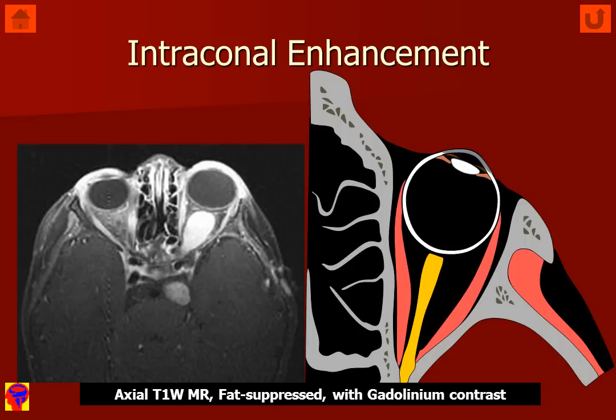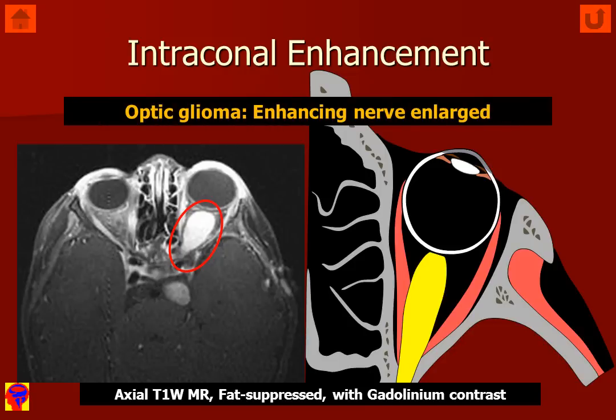If we have intraconal enhancement in a mass lesion, the differential diagnosis changes. We can see here that there is an enhancing mass in the center of the muscle cone. If we look at the diagram, we see an enlarged optic nerve. This is most consistent with an optic nerve glioma, typically an astrocytoma. We must look very carefully for intracranial extension of this neoplasm, and in this case we can see that there is involvement of the optic nerve adjacent to the optic chiasm. So here we have a patient who has an optic nerve glioma.